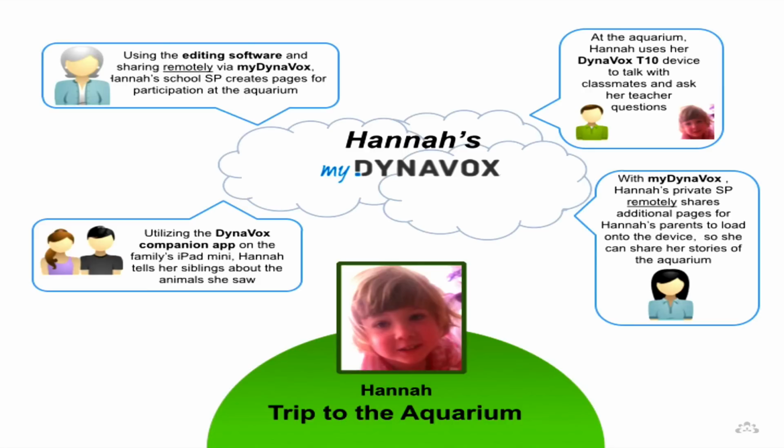Hannah's speechy is creating those pages remotely. She doesn't have Hannah's tablet or Hannah's iPad mini, but she is using the Compass editing software on her computer, making those pages. So that Compass app looks exactly the same on the editor.